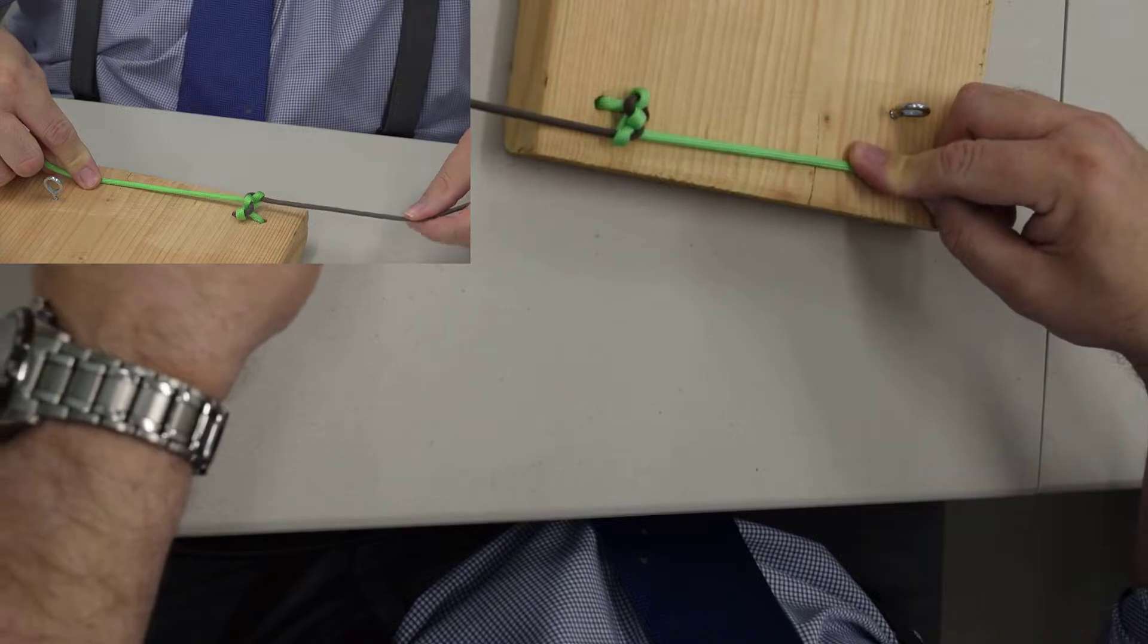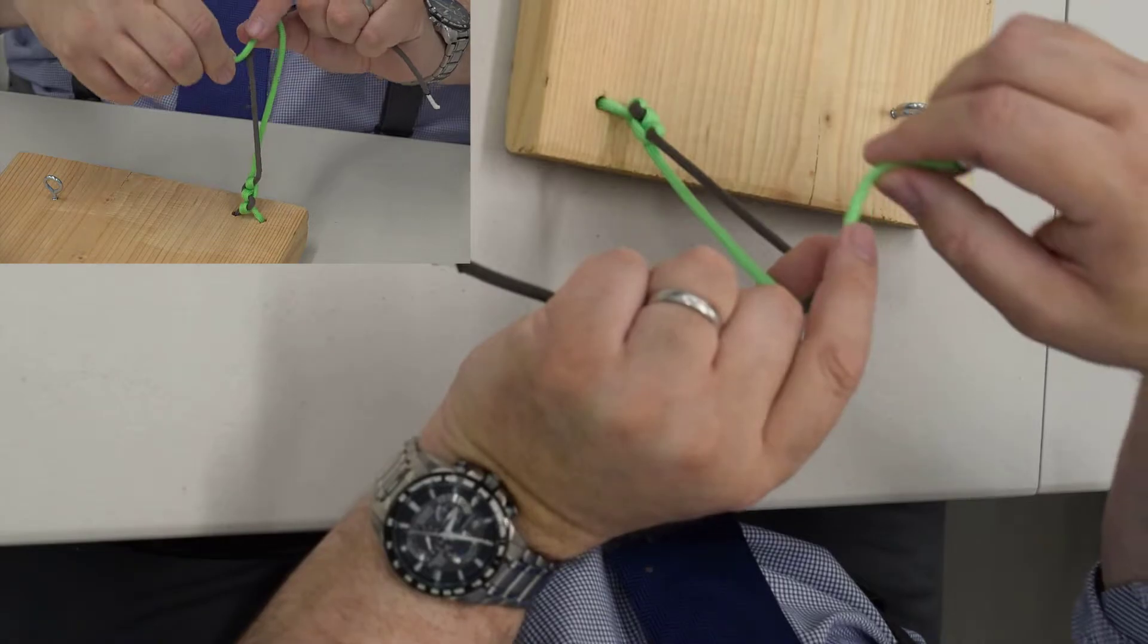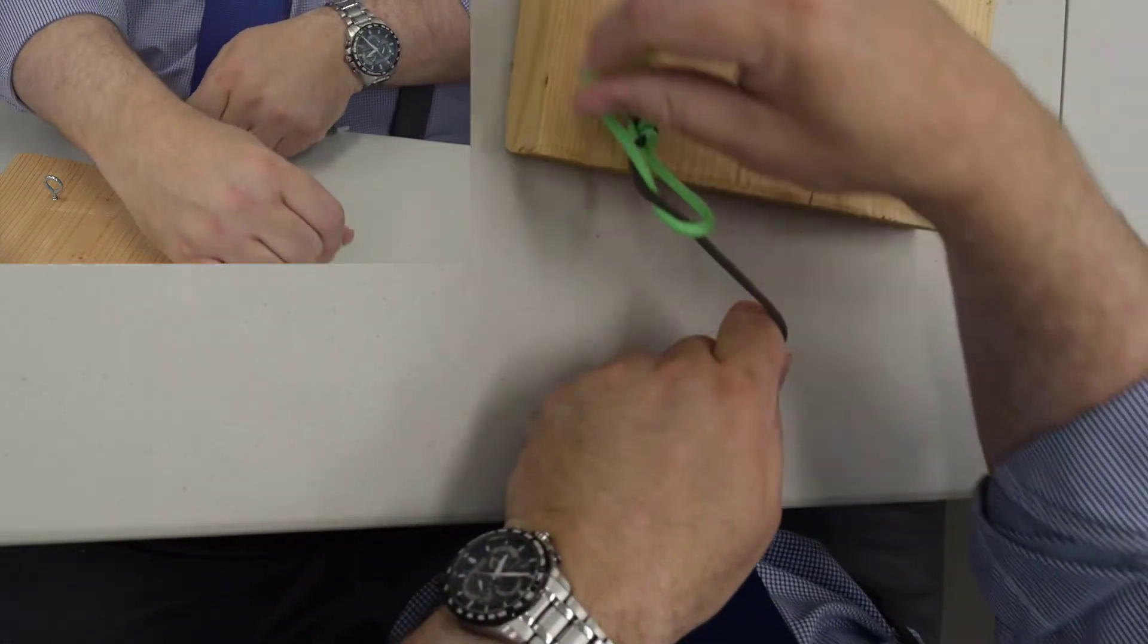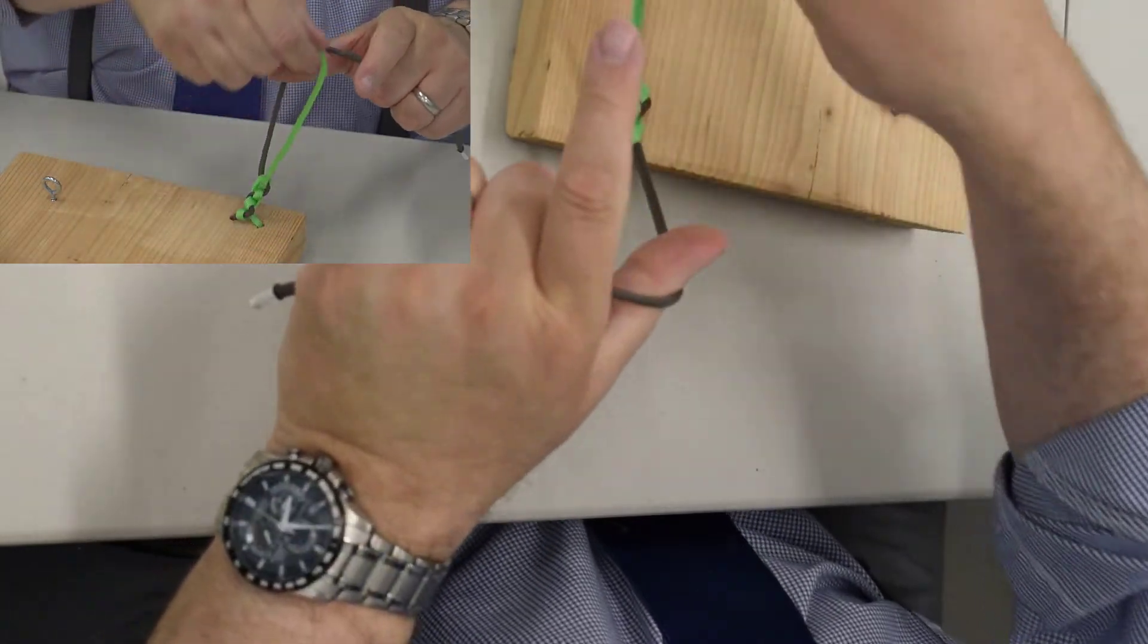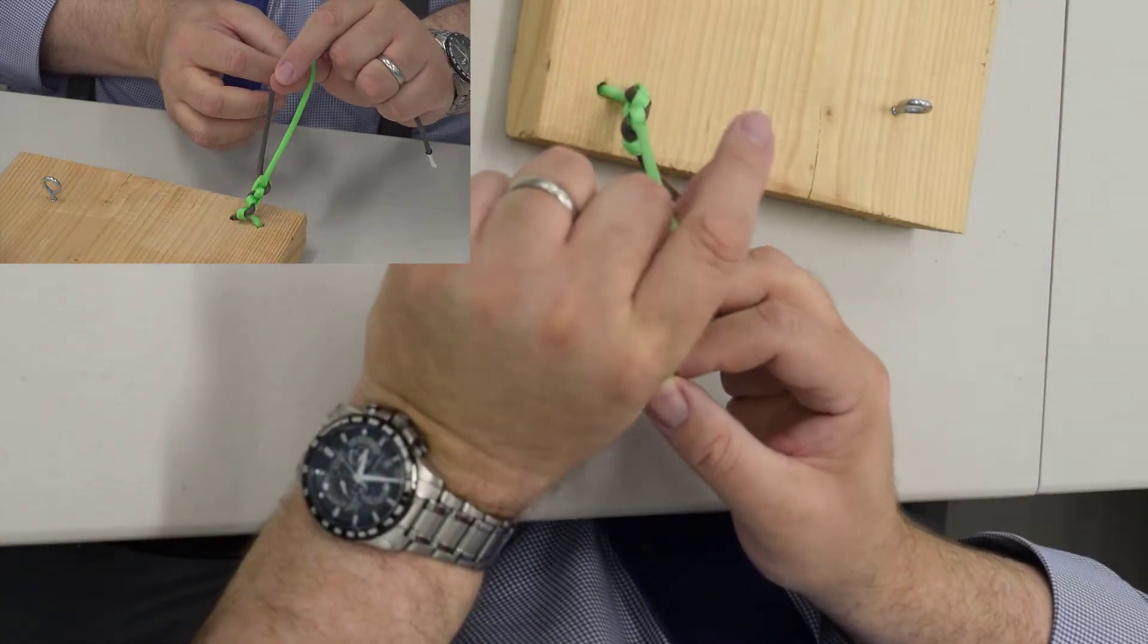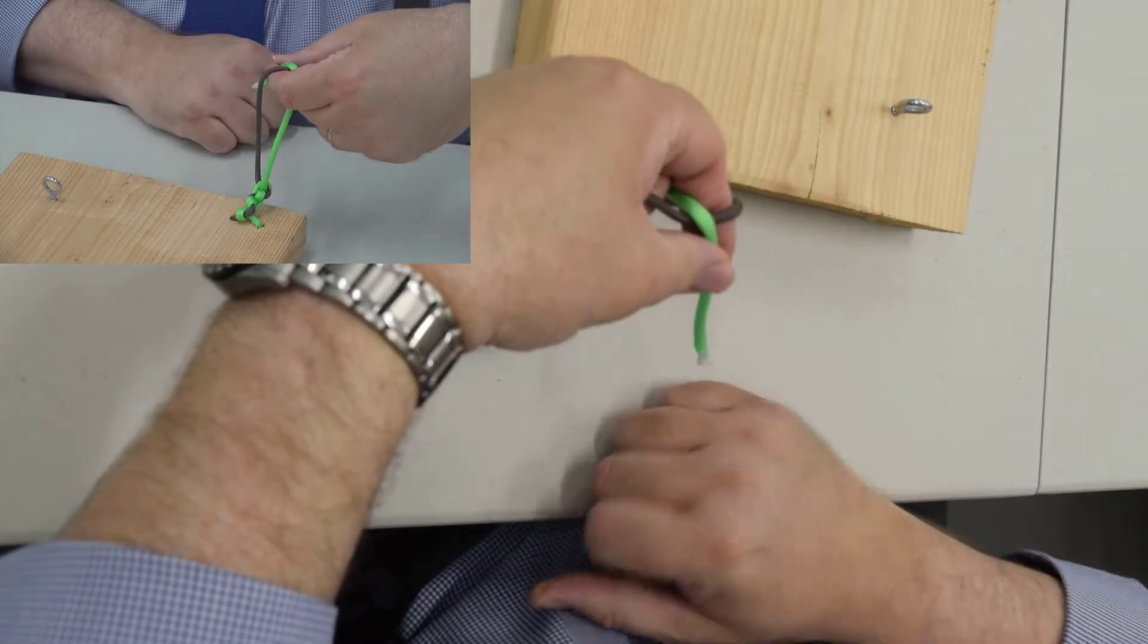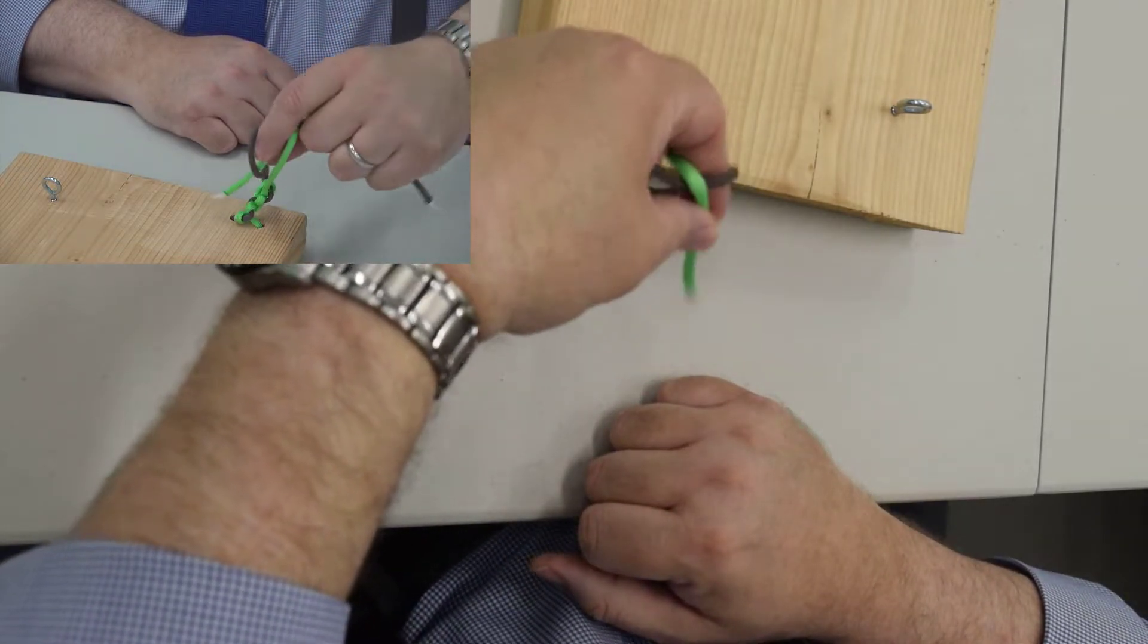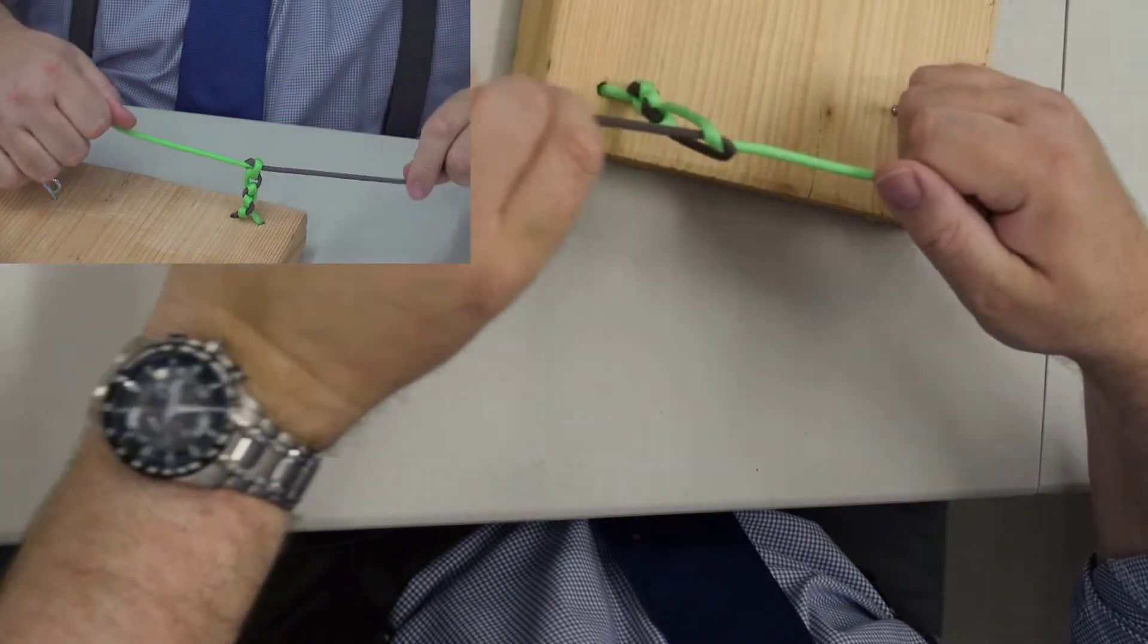Now I'm going to start with gun again, pinch, rotate down, cross my hands. Thumb, crossover, pinch, rotate down, grab the green strand, pull it up, pull it straight down.